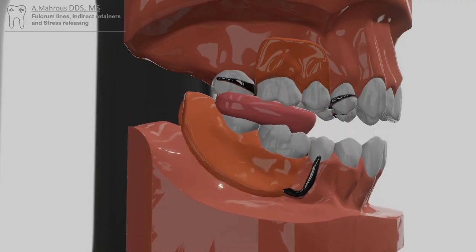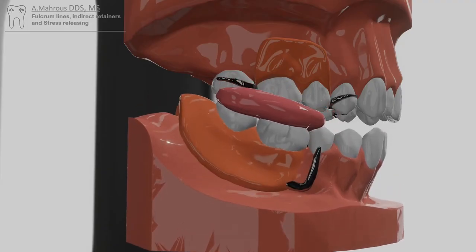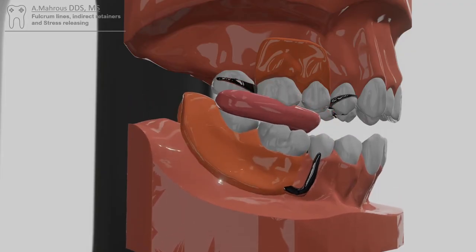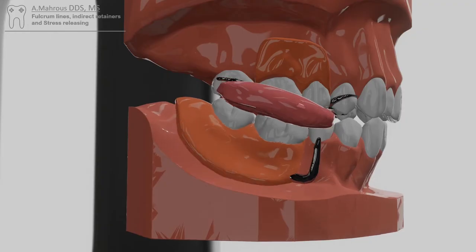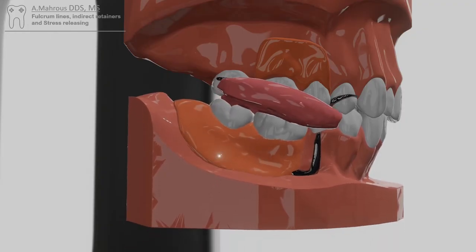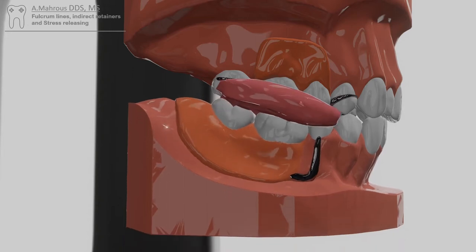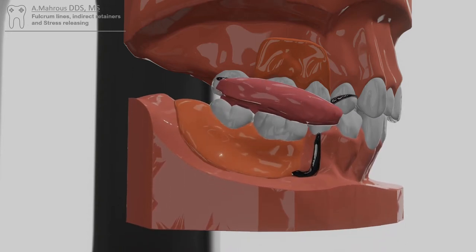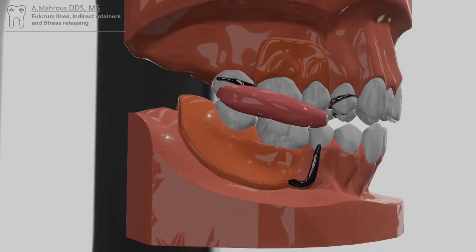As you might notice, much more movement happens on the mandibular distal extension partial denture than on the maxillary tooth-bound partial. This is largely due to the fact that there are no teeth supporting the mandibular partial denture distally, which in turn causes rotational movements towards and away from the tissues. Understanding the reason for this movement, its consequences, and ways of management is an important part of removable partial denture treatment.